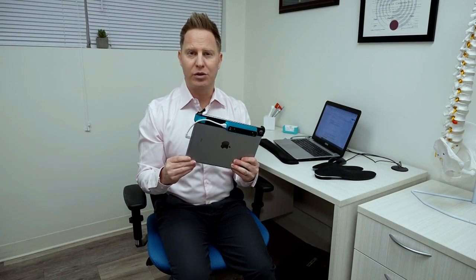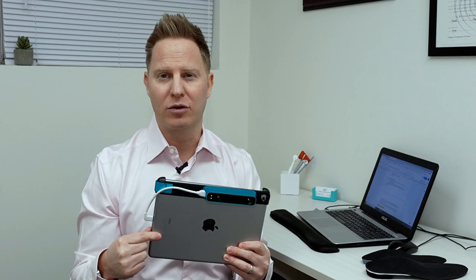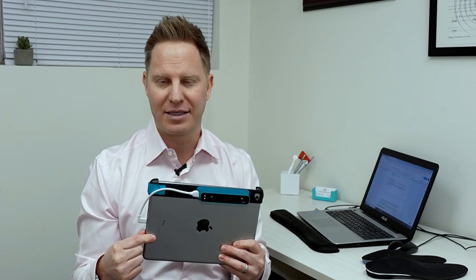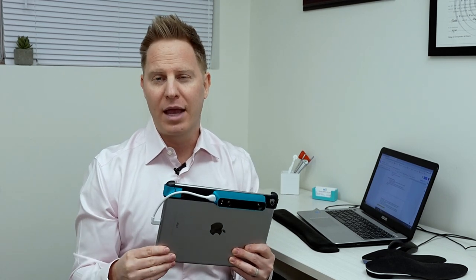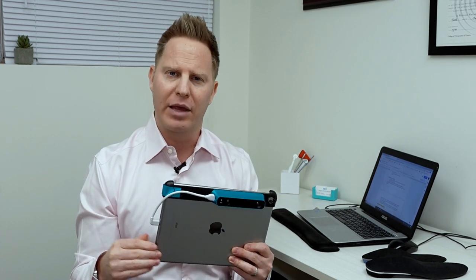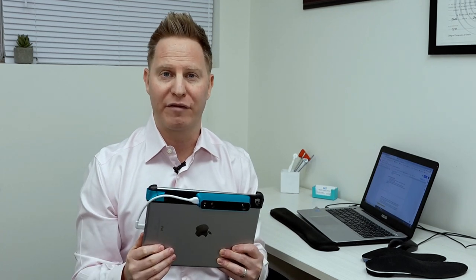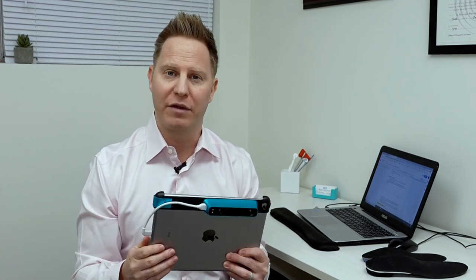The technology we use to take a foot scan is a 3D scanner right here, attached to an iPad. It takes about 10 to 15 minutes, and we do several scans of the foot. We also do a biomechanical and gait analysis with our chiropractor, as well as a hands-on exam of the leg and foot. Then we make a custom orthotic, which usually takes about two to three weeks to arrive. They're handmade and custom fitted for each patient.